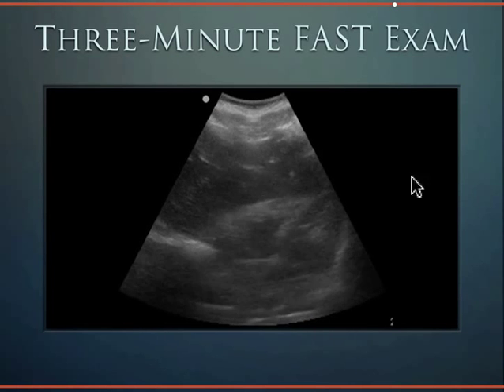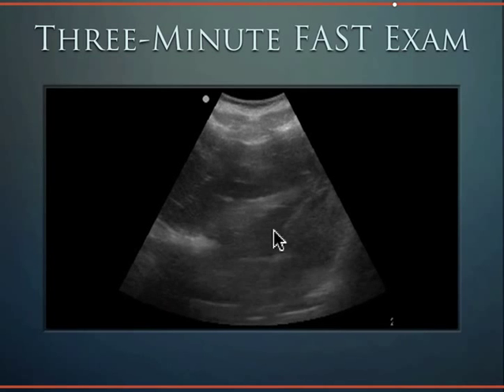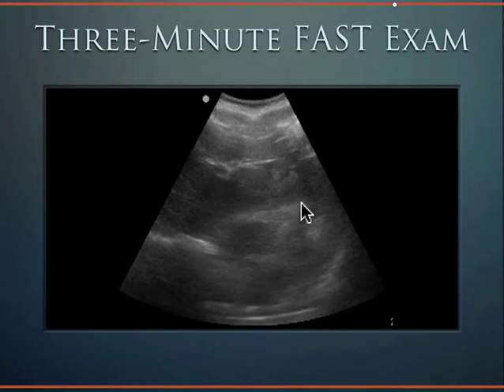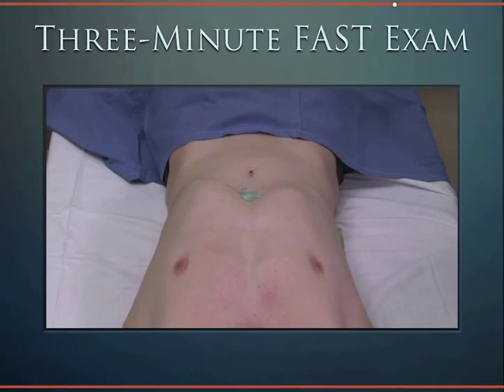The heart should come down your screen. Here is the liver, here's the right ventricle, here's the left ventricle, here's the interventricular septum. The pericardium is traced around here.